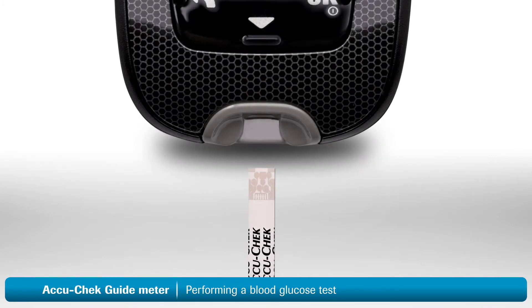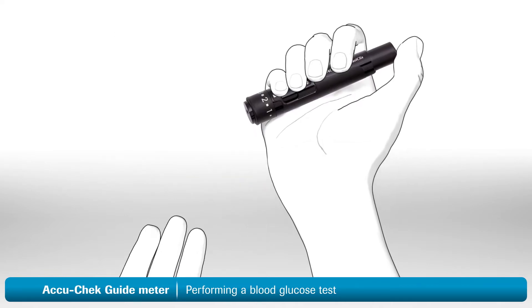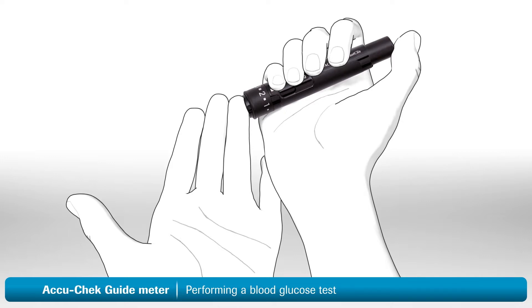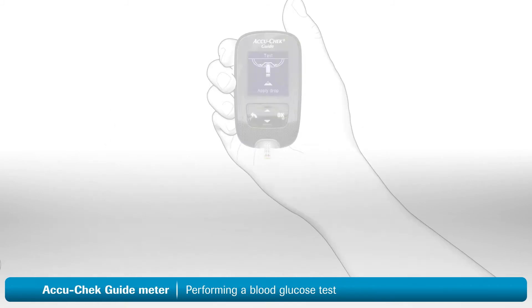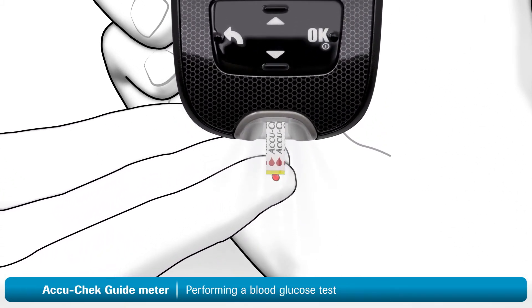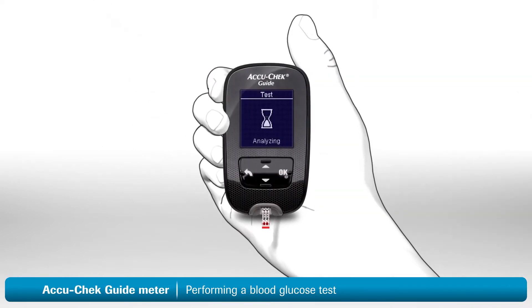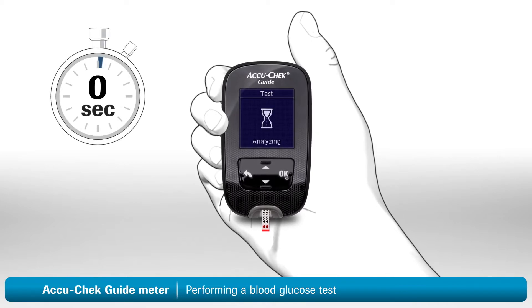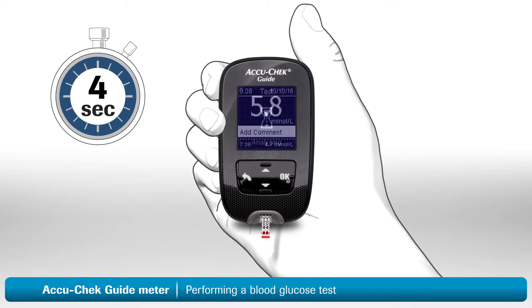Insert a fresh test strip, metallic end first, into the meter and the meter will turn on. Notice that the test strip port light allows for easier use in darker environments. Now it's time to use the lancing device. Place the pinhole opening firmly against your finger and press the release button all the way down — this will lance your finger. Massage the finger in the direction of the fingertip to help the blood drop form. Touch the yellow edge of the test strip to the blood drop. When enough blood has filled the strip, 'analyzing' appears on the display. Remove your finger from the strip. A small hourglass symbol will rotate on the screen to show you that the meter is working. Your blood sugar reading will be ready in less than 4 seconds.